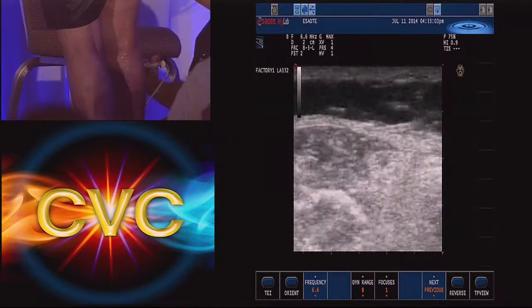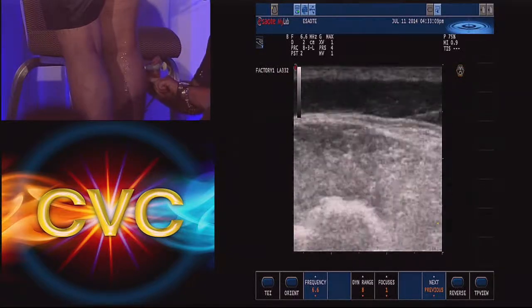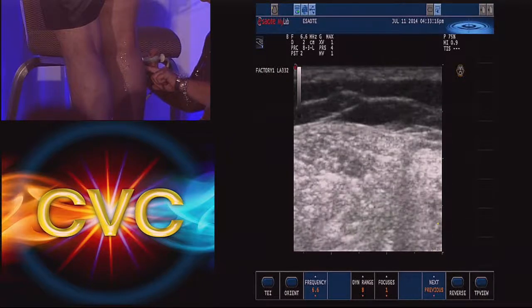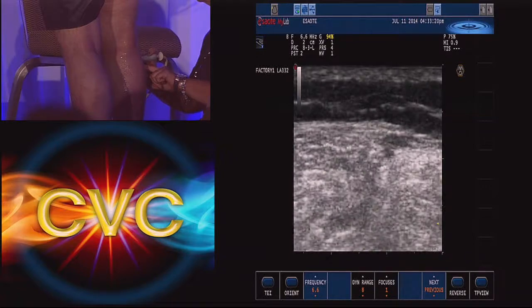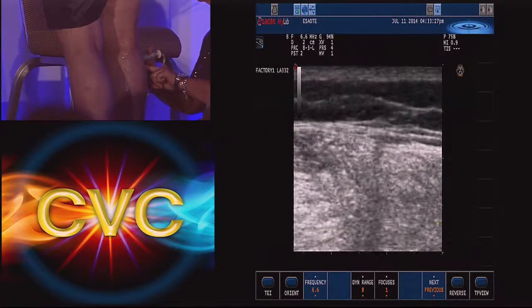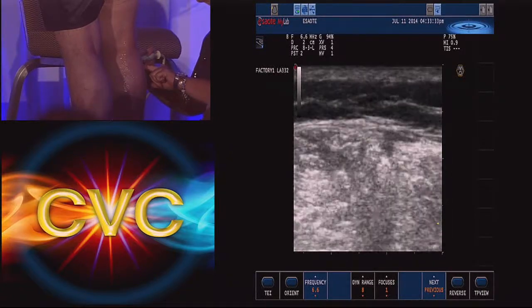Thank you. So you see how she's following that branch, and you look at the corresponding site, and at some point you'll see a perforator that is feeding from both sides. So after you treat the upper part, if you don't treat anything else, and there's reflux from below as well, this will continue to stay under pressure, and it'll try to recanalize what you occluded. So you kind of have to think of where the pressure is coming from and take care of both of those. Did you find it? Right there?